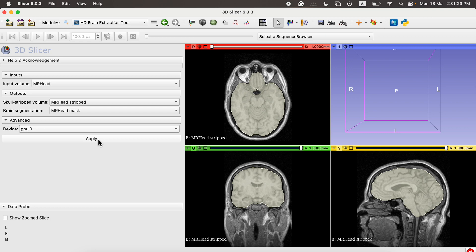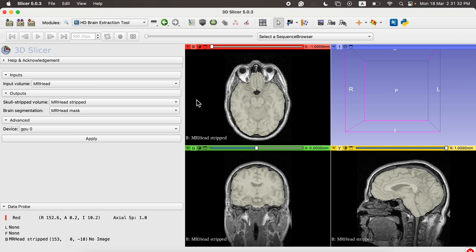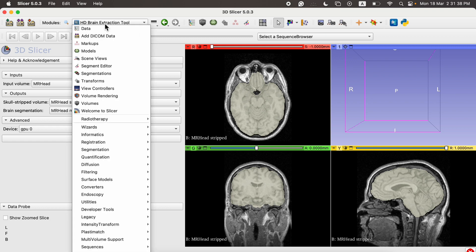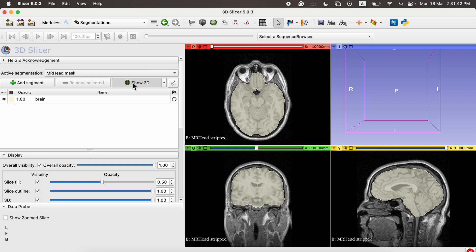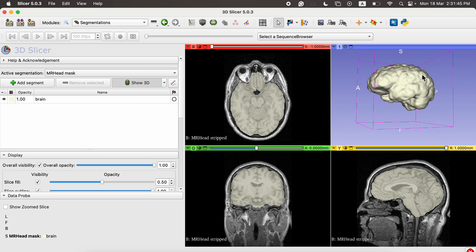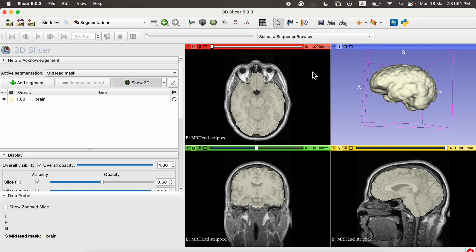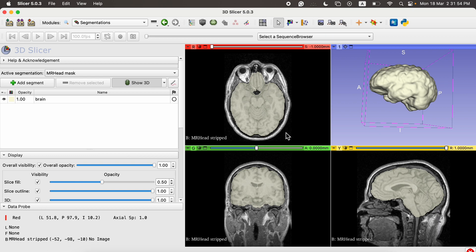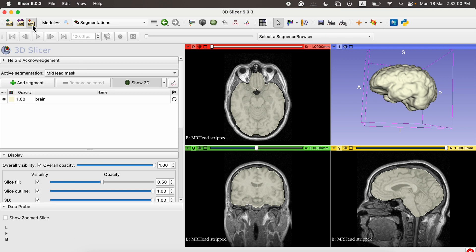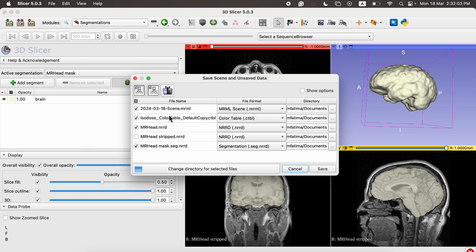The AI segmentation took some time and has accurately segmented out the regions. Going to the Segmentation button and viewing the 3D version shows a much more detailed brain extraction — no need to perform separate segmentation for artifacts as it has already been delineated. Once satisfied with the output, click Save, which shows options to save the MR head image and the segmentation image.